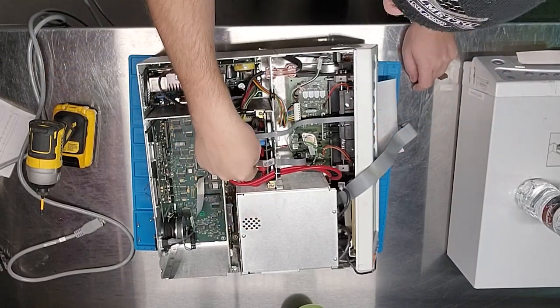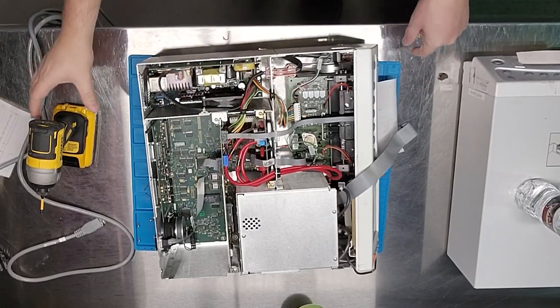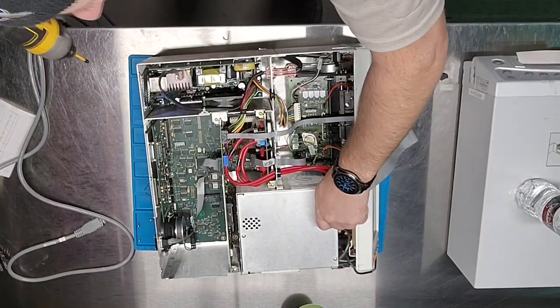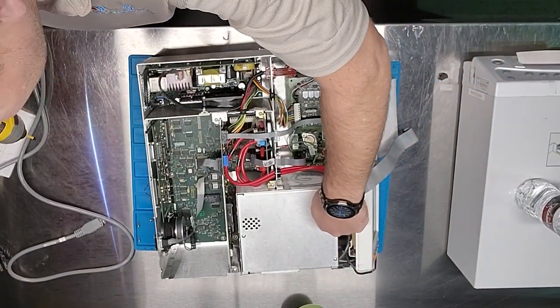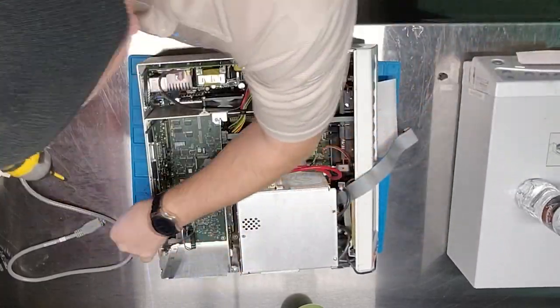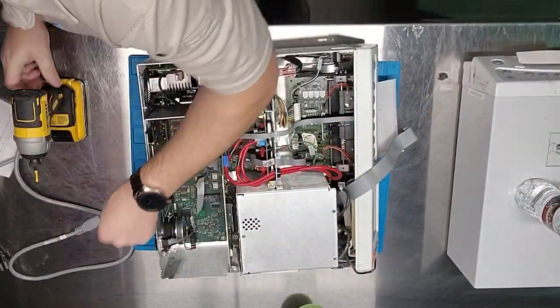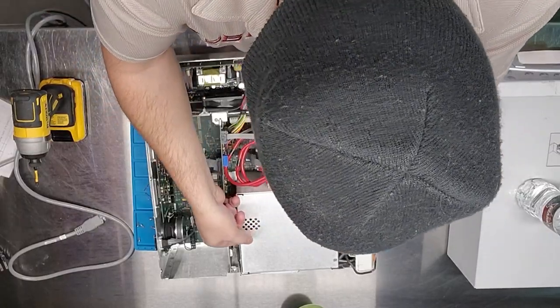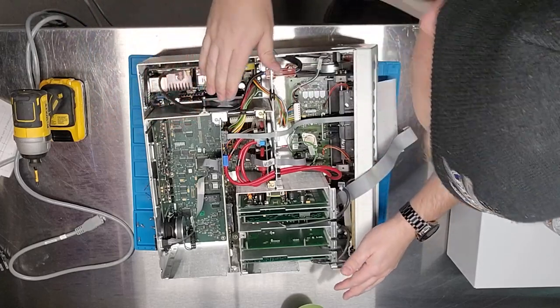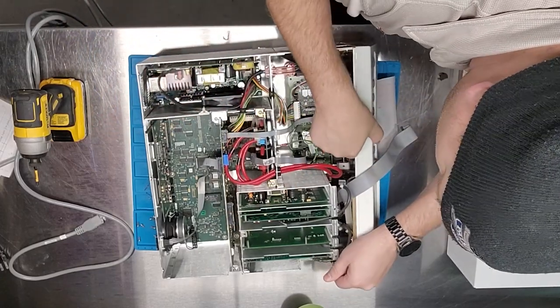The NIBP pump is pretty standard and serviceable — you can find it on many other devices, desolder it, put another one in. There are two different variants: one is 6-volt, one is 12-volt. They look identical, just the windings are different, so make sure you get the correct voltage when swapping.